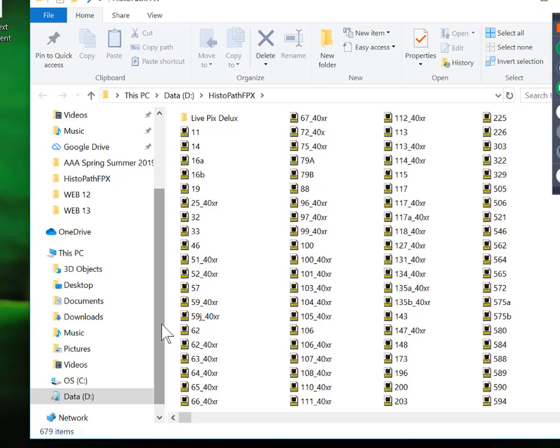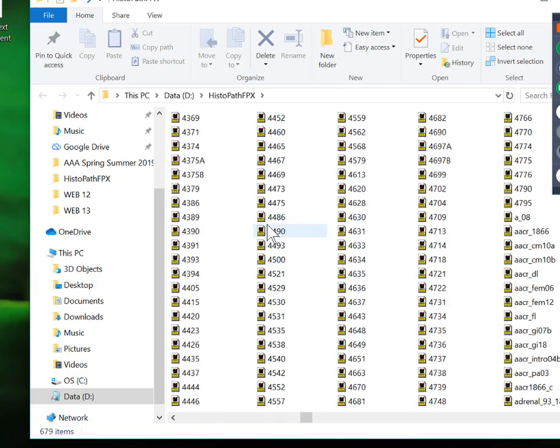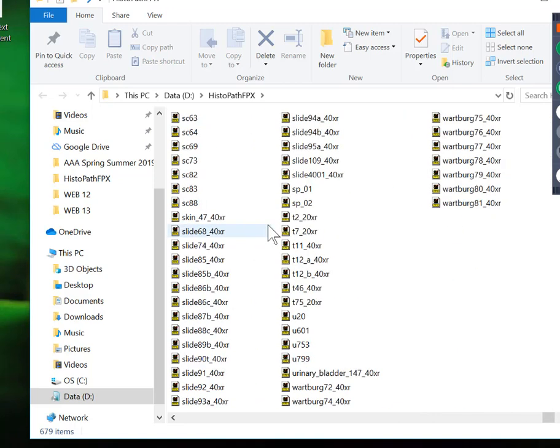So let's continue, and we're going to go into now an organ in which cancers can be seen without surgery or without x-rays, and often even diagnosable without a microscope. So we're going to go to slide number T2, which I think is going to be near the end because it says T on it. So here we are, we're in the S's, and now here's the T's, and here is T2.